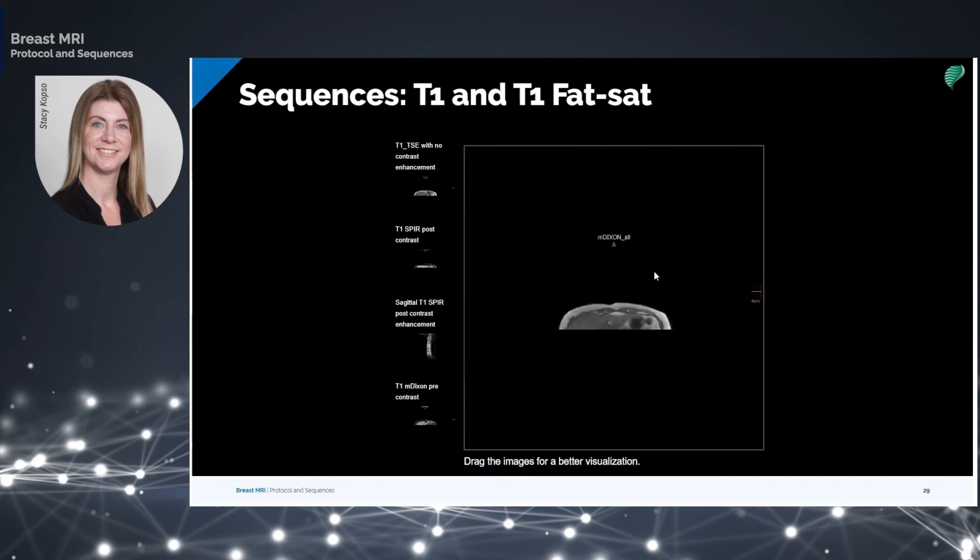A non-fat suppressed pre-contrast T1 demonstrates fat at hyperintensity. The normal fatty tissue, enlarged lymph nodes, and fatty lesions all appear hyperintense in a T1-weighted image. By canceling out the fat signal within the breast through fat suppression, the signal of fatty lesions should also get suppressed. This occurs in cases of hamartomas, lipomas, and fat necrosis.